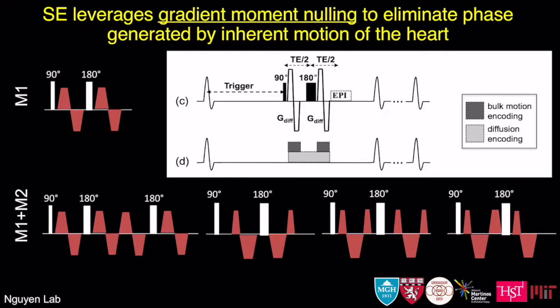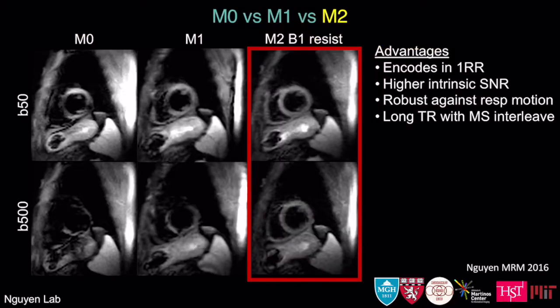And so I started looking at some papers. There were some groups that were looking at just doing velocity compensation. This is very familiar to you in this top row here, what they do for flow compensation. And then I started to make all these different pulses, which are on the bottom, to get the second order motion compensation. And it seemed to kind of work. It actually worked very well.